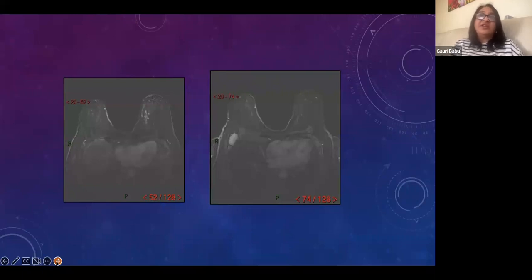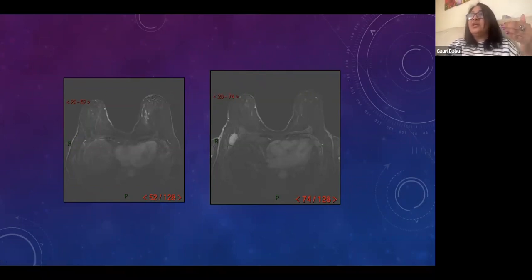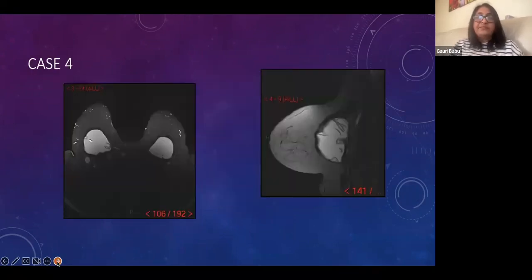So there was a discussion again in the MDT. So we took the lady up for a second look ultrasound. We found some kind of textural hypoechoic change in the medial breast. So we biopsied that on the left-hand side. And then the lady essentially had surgery, then axillary node clearance on the other side, and she had radiotherapy. So it was quite an interesting scenario.